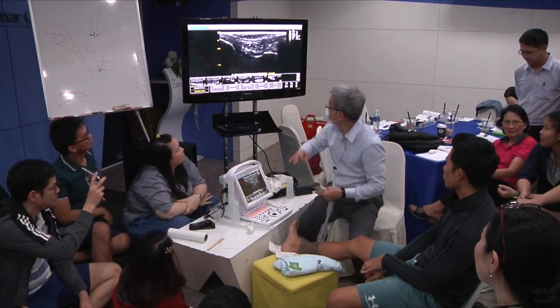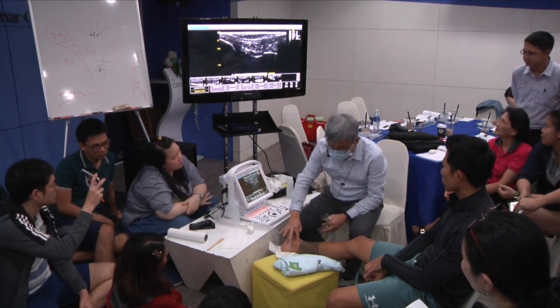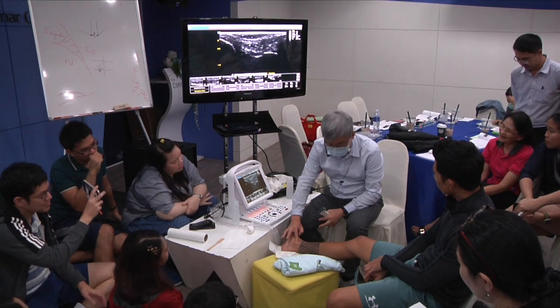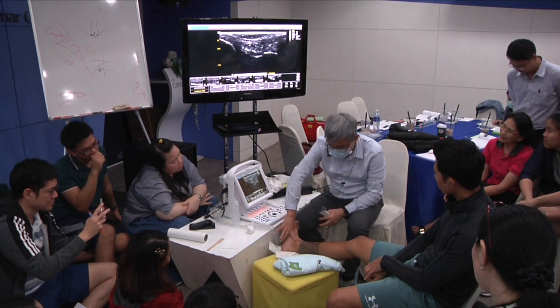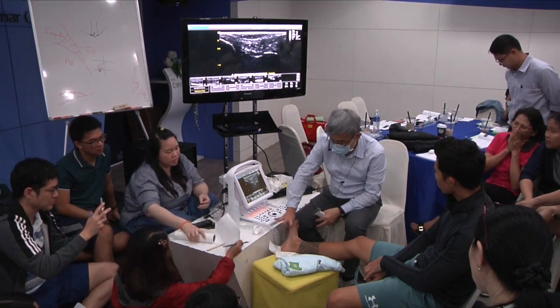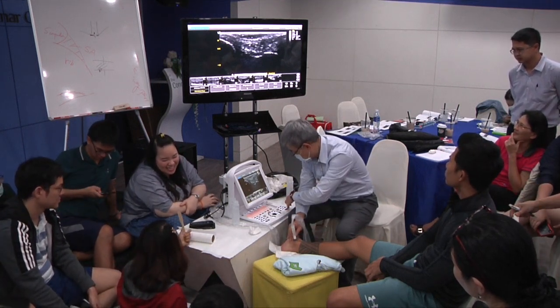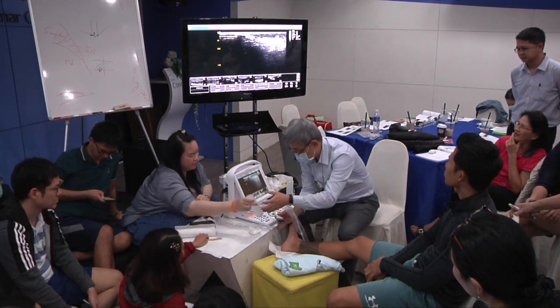So it takes a while to find because the medial malleolus is quite big. I stayed in here, but I found it's in here. The origin of the anterior bundle is here. So you probably need to use the heel walking around the medial malleolus to find the anterior bundle. Okay, no, it's all right. Okay, do it again. Thank you.